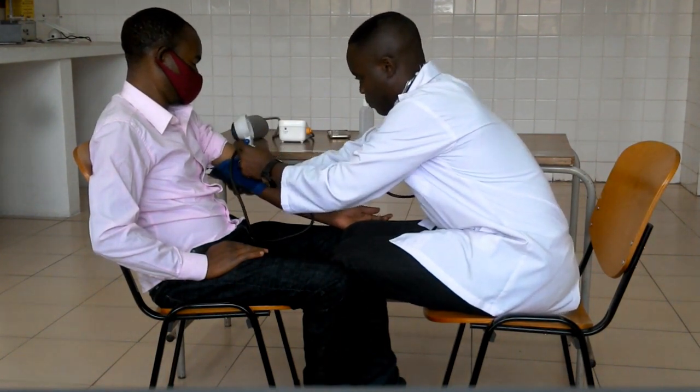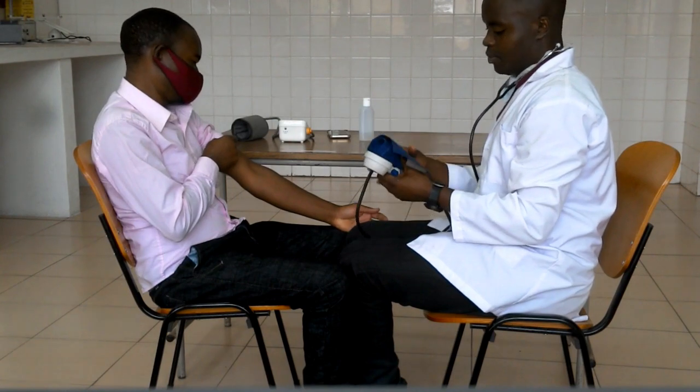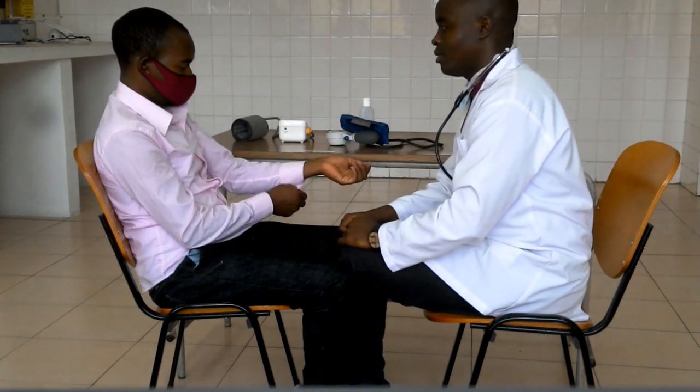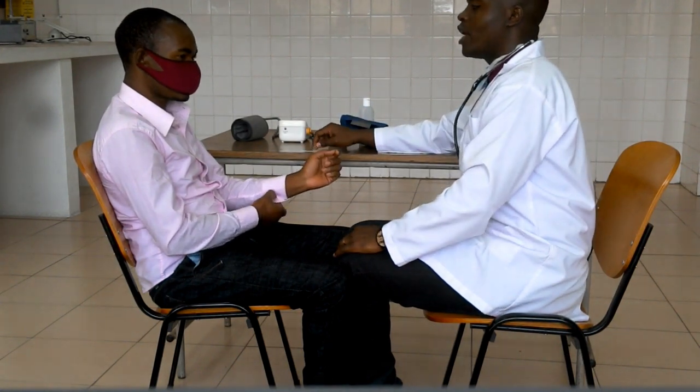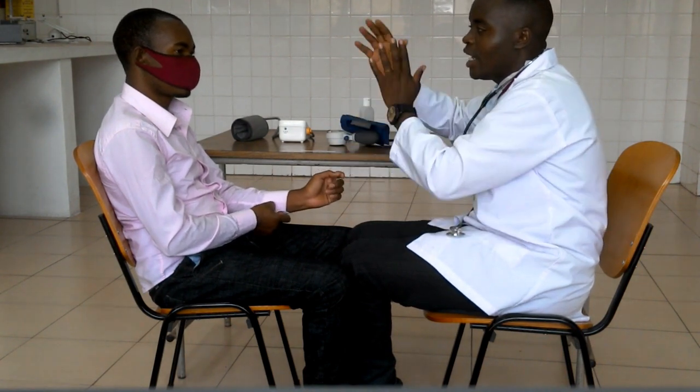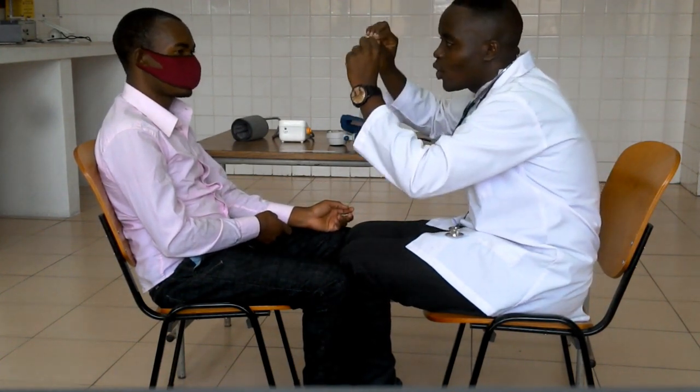We are done. Unwrap the cuff from your patient's arm and thank your patient. If the patient has questions, welcome them to ask. The patient asks: how is my result — is it normal, high, pathological? The reading was 125 over 80 mmHg. The normal range for systolic pressure is 90 to 140, so 125 is within normal range. For diastolic pressure, the normal range is between 60 and 90, and the reading of 80 is within that range. We are in the normal range for both systolic and diastolic pressure.